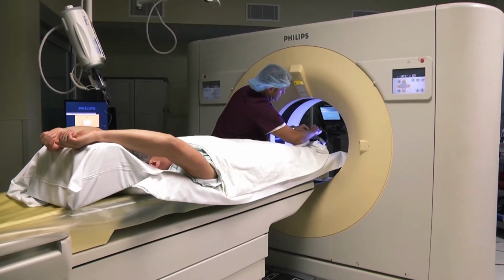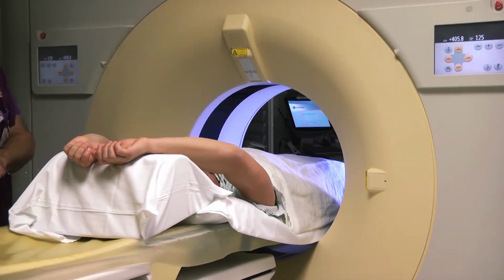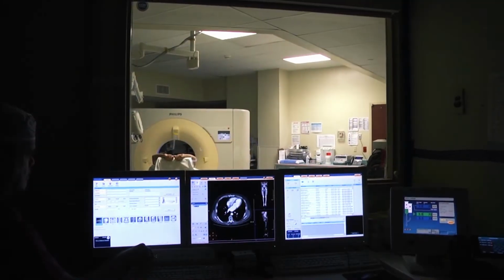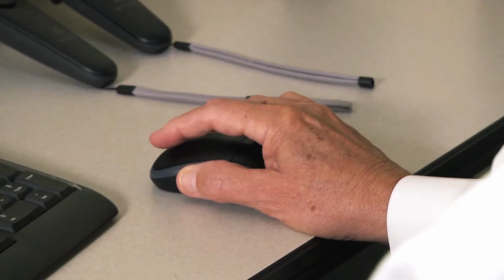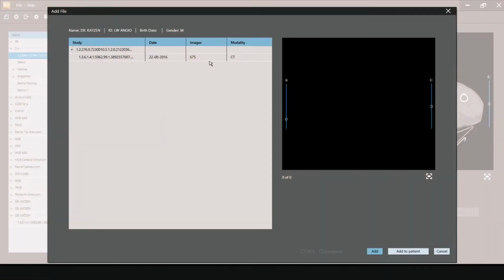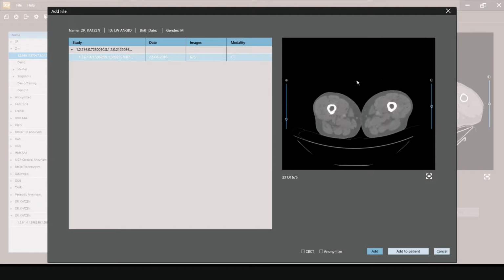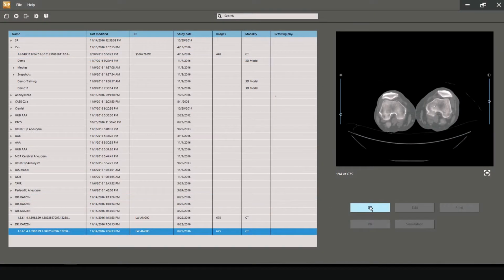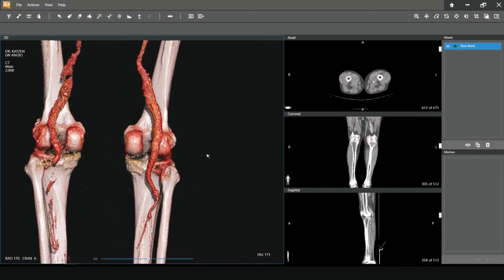So what we've been doing is taking CAT scans, which most people know what that is, and they're very frequently done now, and taking the unique data that comes from a CAT scan, which is very detailed. It's a group of X-ray slices that the average person couldn't make sense out of. And taking all that information, putting it all together with computers and generating essentially a model that anybody can understand, patient, physician. It can be made in very detailed referencing, which is basically the patient's specific anatomy. It's not like a make-believe type of model.